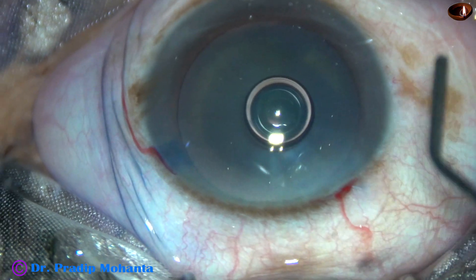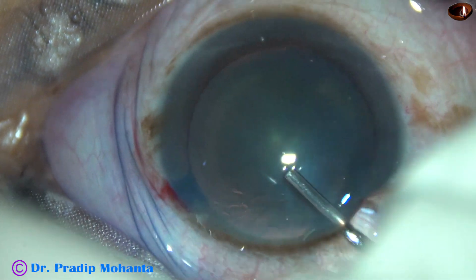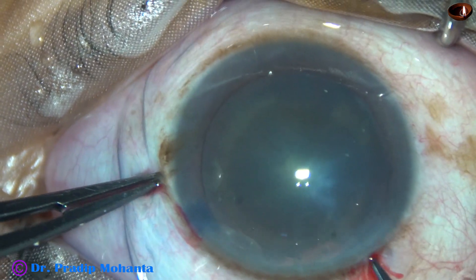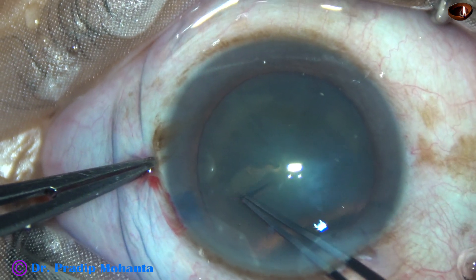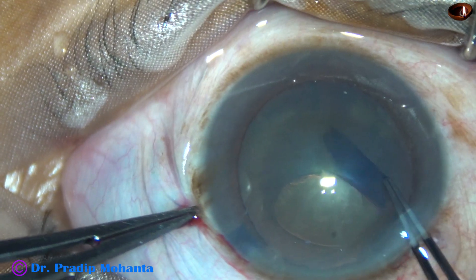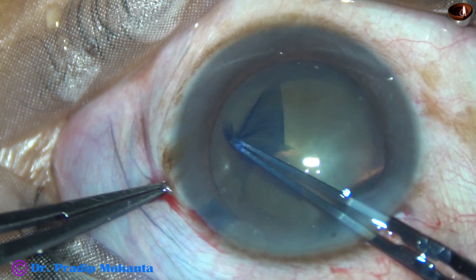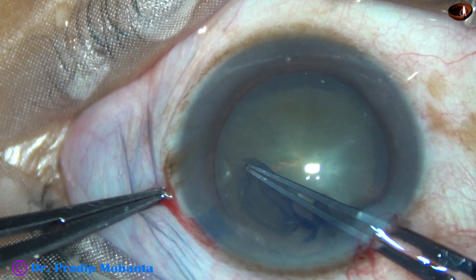2% hydroxypropyl methyl cellulose is used to fill the anterior chamber. Capsulorhexis is done with the help of utrata forceps. The capsule is incised and a tag is raised, guided anti-clockwise. The size of this rhexis is about 5.5 to 5.75 mm.